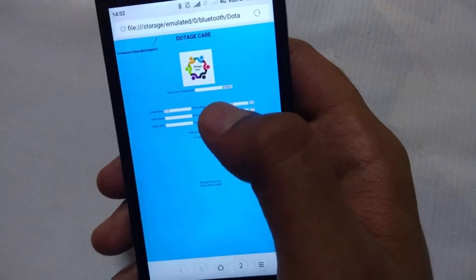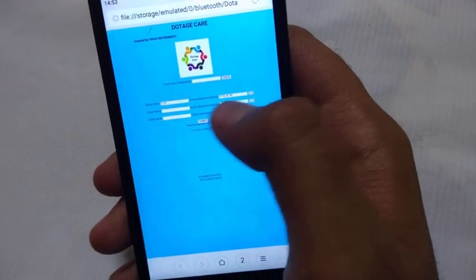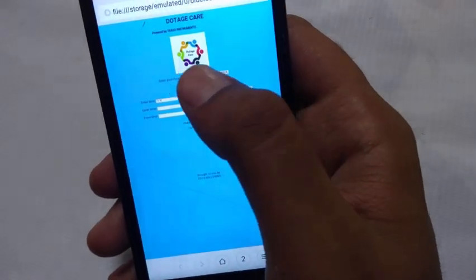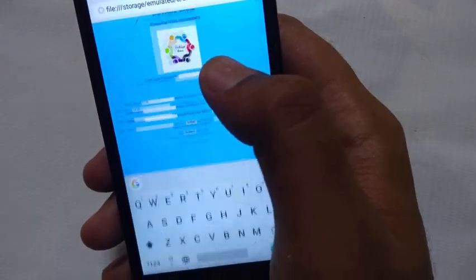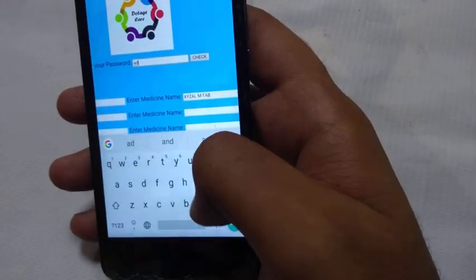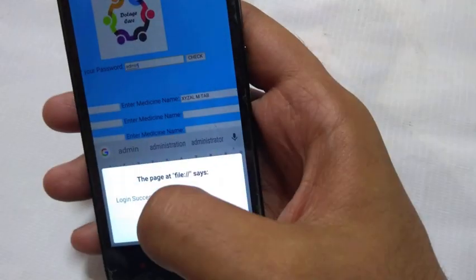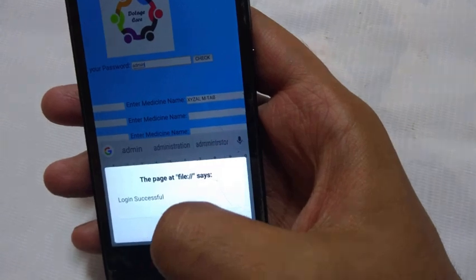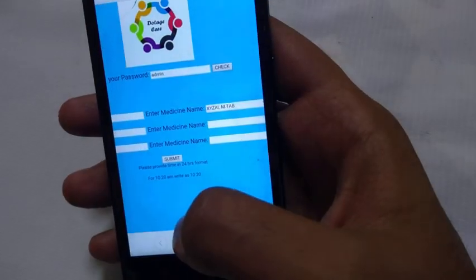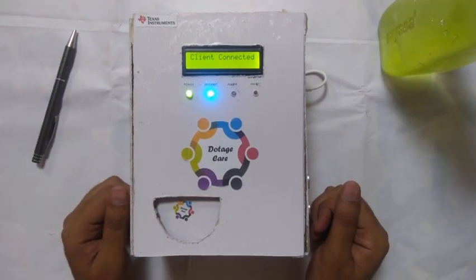This is the UI of the dotesca system. The name of the medicine and the time is provided in the respective boxes. As we enter the default password, that is admin, and press the check button, the data is submitted and the dotesca system is ready to be used.